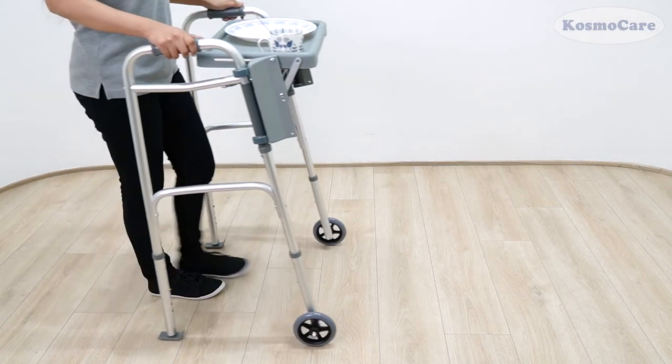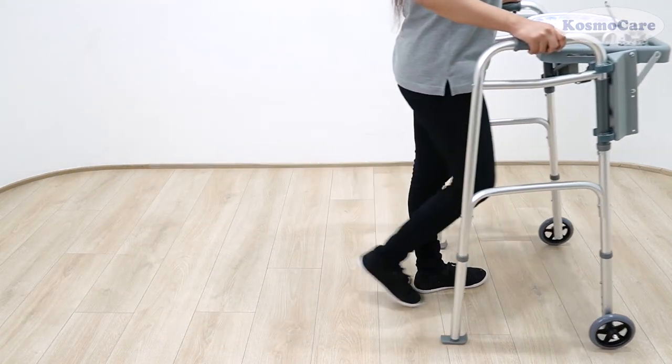So, give your loved ones the convenience they need with the walker tray from CosmoCare.